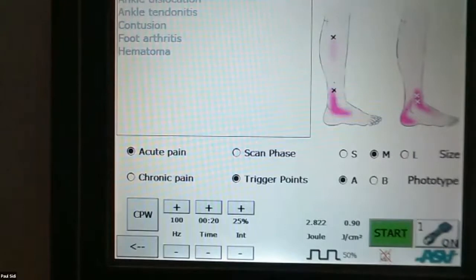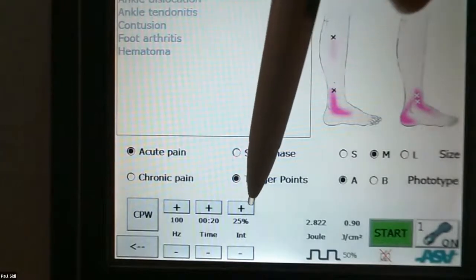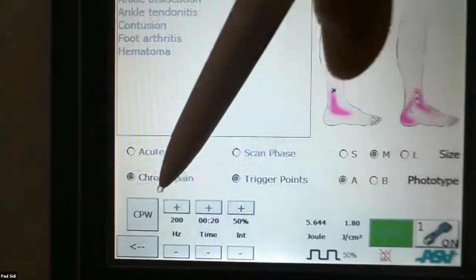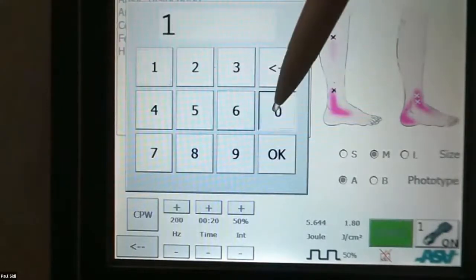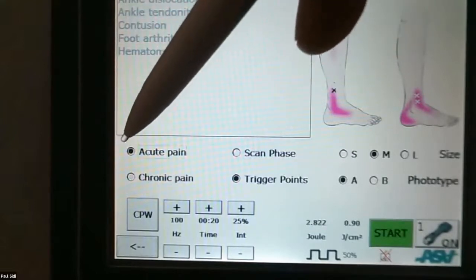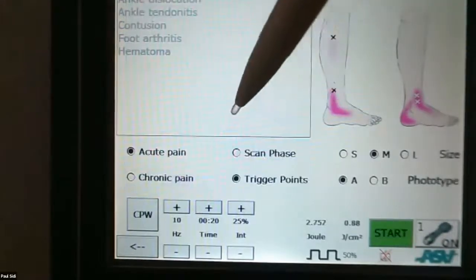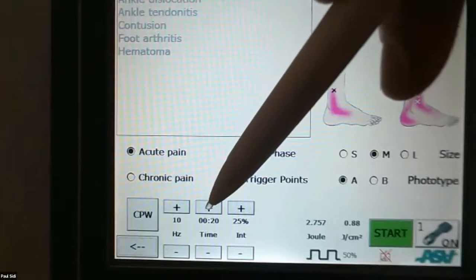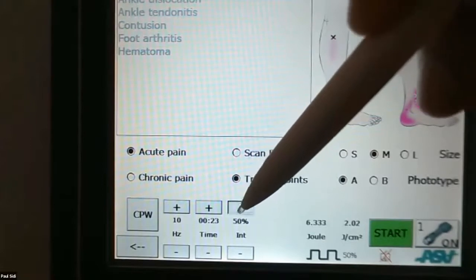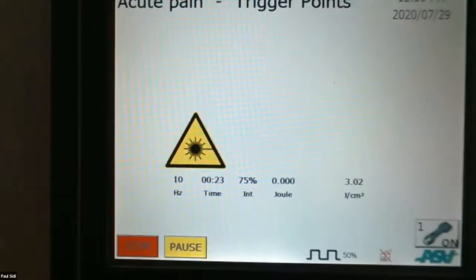Okay, as I said before, comes up 100 hertz, 20 seconds, 25%. What we do here is just press on the 100, change that to 10. Okay, 10 hertz. It doesn't matter about that. Okay, 10 hertz, 23 seconds. Don't ask me why it's 23 seconds. The Italian said it is. Get up to about 75%. Okay, now we press start again.